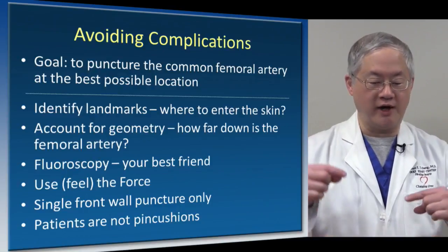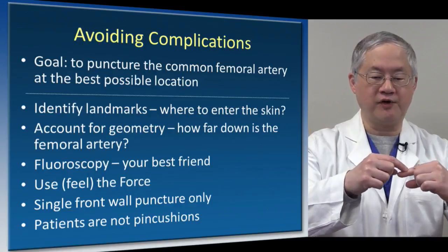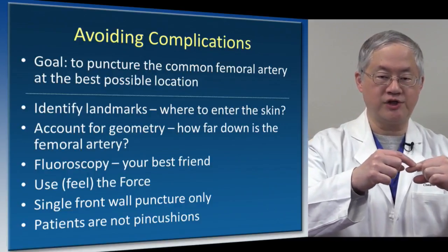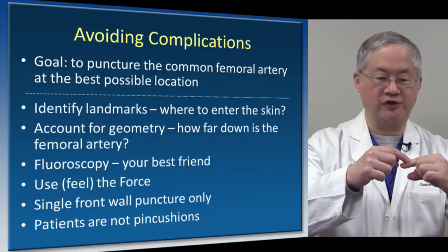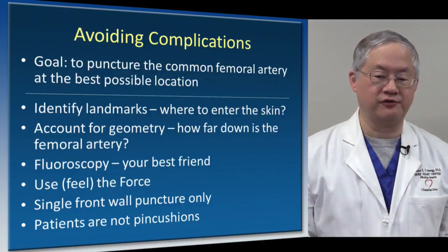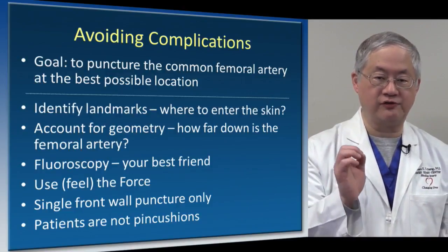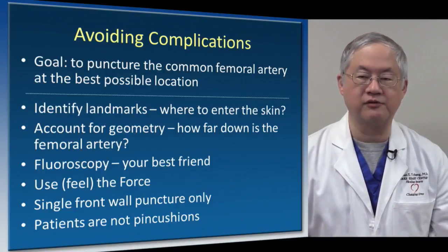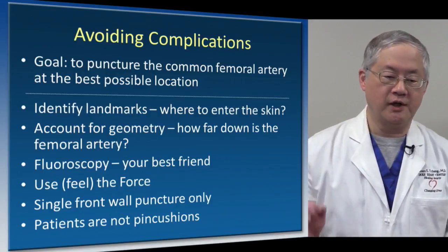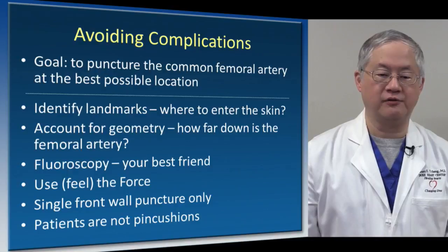If you're doing this right, as you introduce the needle, you should actually be able to feel the artery pushing back against you so that you know exactly where you are as you're trying to puncture into the vessel. Even the vein has some resistance as you're trying to access it with the needle. Single front wall punctures only really are the standard.